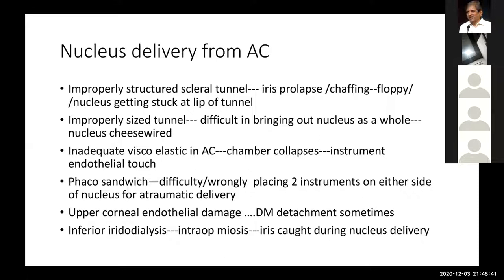Commonly the Sinsky hook can touch the corneal endothelium. And every time you notice the anterior chamber collapsing, or if you feel the anterior chamber is shallowing, you should just stop in between and inject viscoelastic.